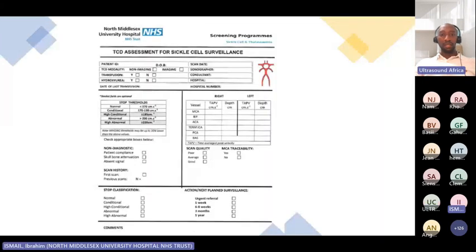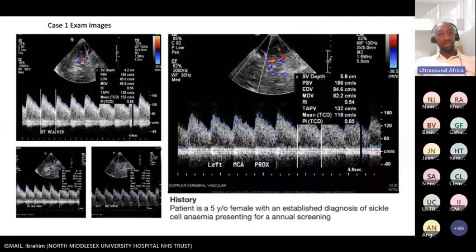All right. I guess the follow-up question to this would be, so what do you consider then? Do you use an average of all these measurements that you're taking? What if one of them is falling within conditional and one is falling within the abnormal?